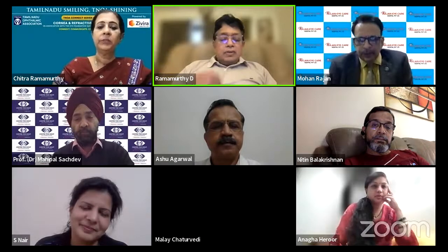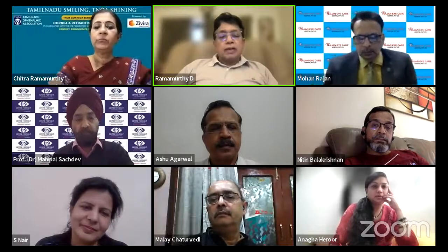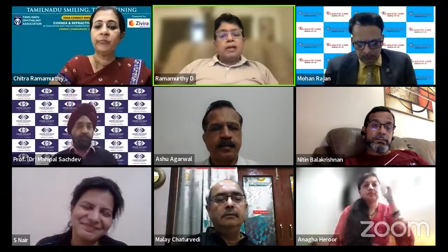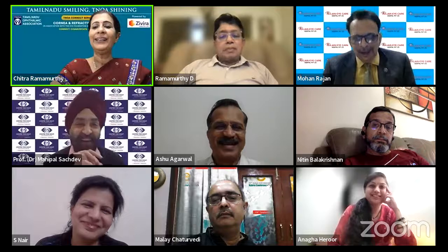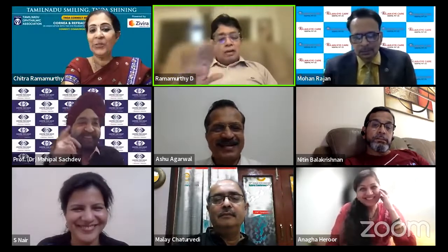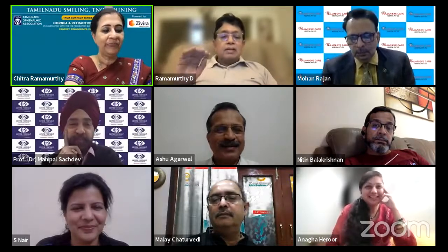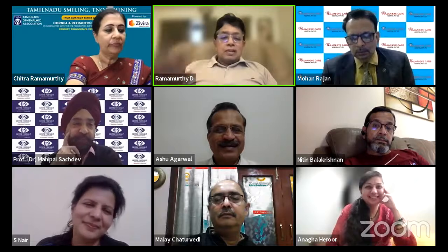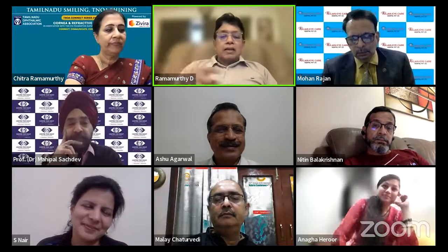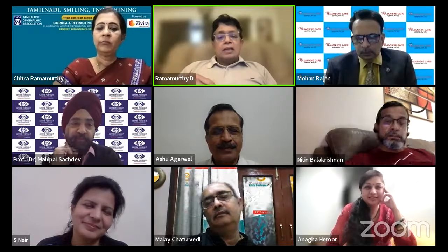Nice videos, Swapna. I think it just reiterates the fact that, though we have all invested in the laser, we should stop using it for creating incisions. Yeah. I kept struggling with it initially. I thought I paid so much, I should create incisions. But now I've stuck to my blades and I get it exactly where I want, a limbal incision, 2.4 millimeters, and no struggling with this thing and trying to open it up. Sometimes it's so uncontrolled. You have an arcus, it doesn't open up. I think this is one more reason. But as far as the other parts are concerned, I completely agree with you.